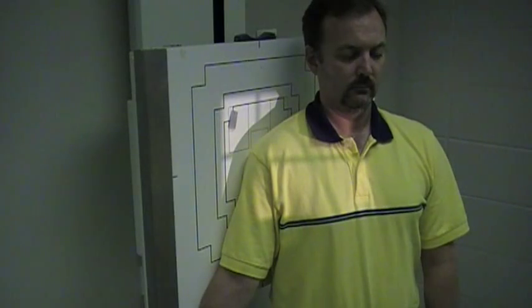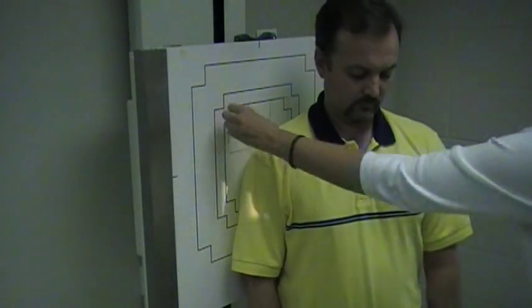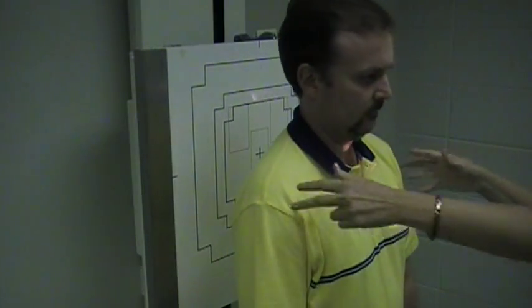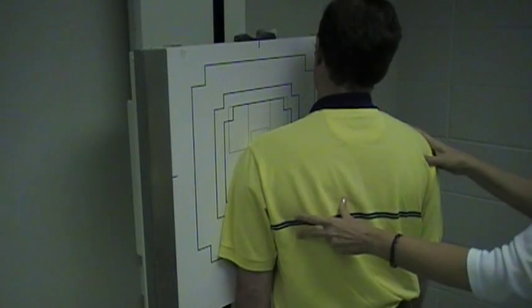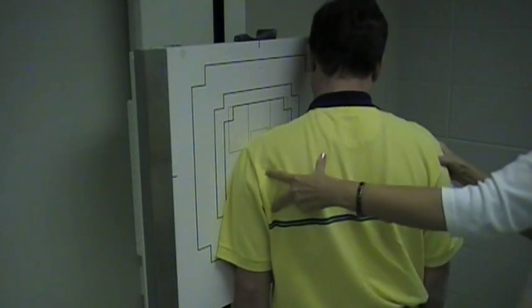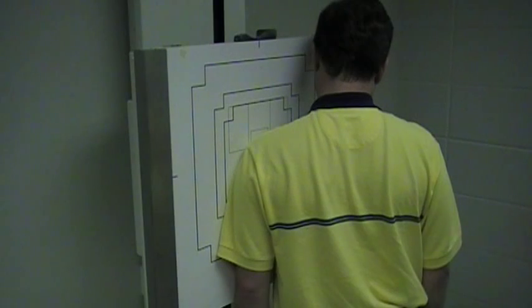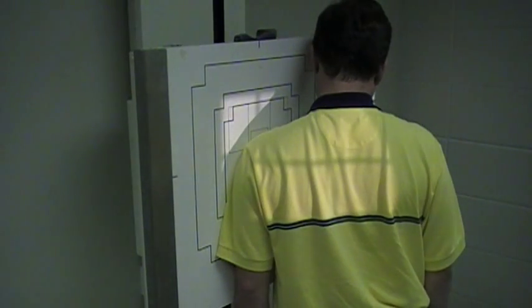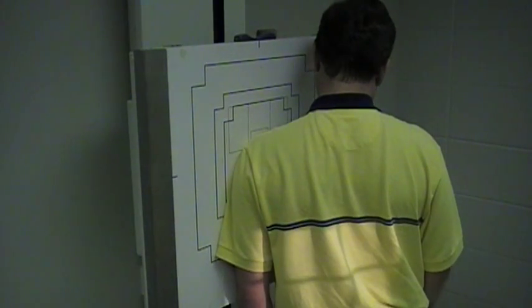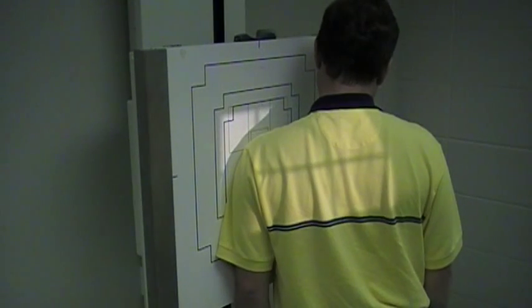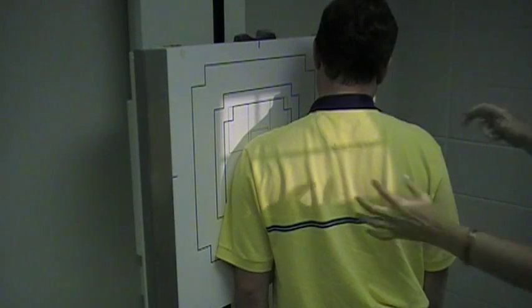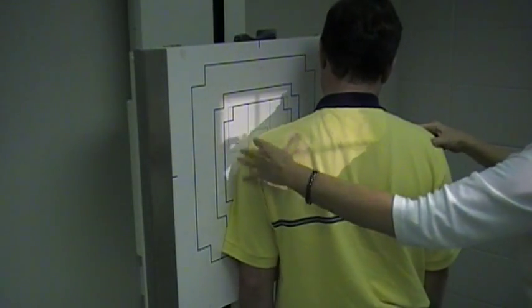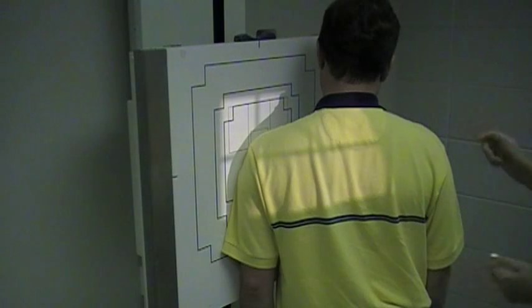Our last special projection is the near method, and I'm going to do the left shoulder for this. I'm going to have David turn, and we will have him in a PA oblique. You can do a body oblique of 45 to 60 degrees. You're going to have a tube angle of 15 degrees caudal. This is really a tangential projection, and it's going to be skimming over the top of his shoulder.